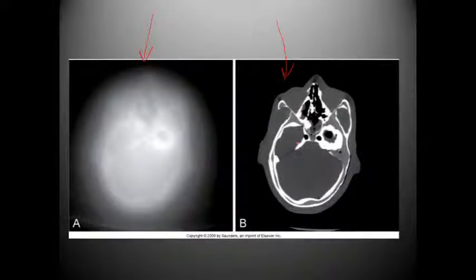The reason we can say that is because the brain has a certain density to it, and we can visualize the bony anatomy as well. Here we have air in the sinuses, as well as some mucosal thickening, very important in this area. Here in image A, we cannot visualize very much of anything. We can see a little bit of the sinuses, but that's pretty much it. So image B would have excellent spatial resolution, where image A would not have any.